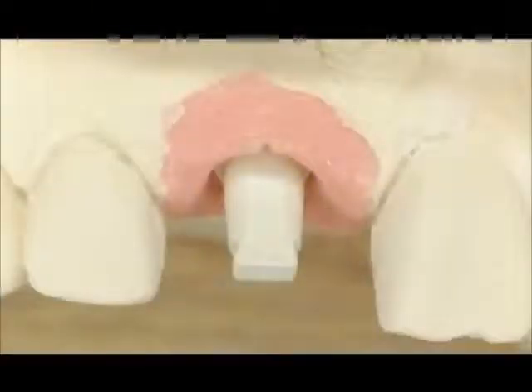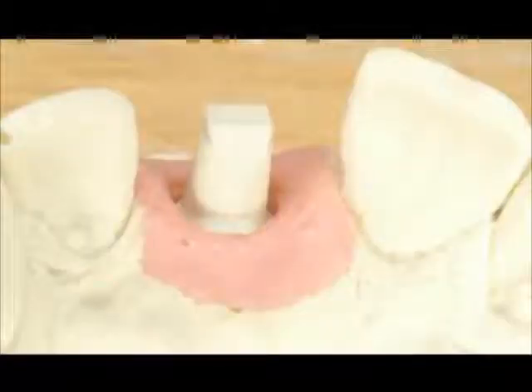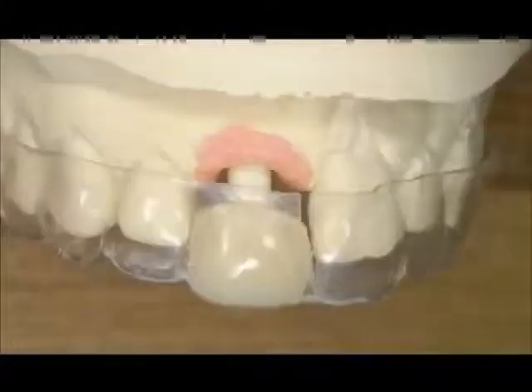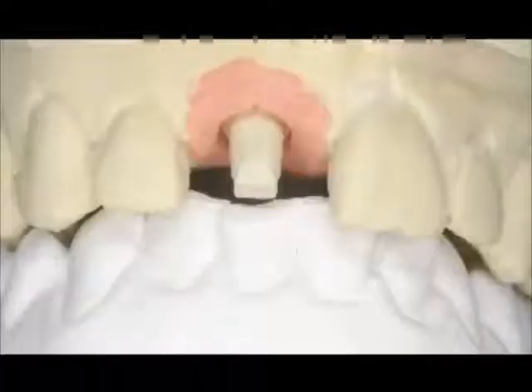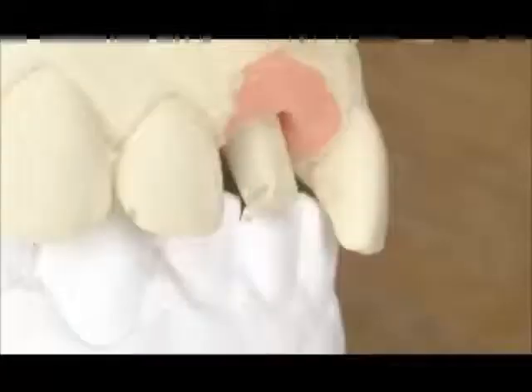This is what it would look like poured up in the laboratory model. You have a chamfered margin and you have a soft tissue rendering of what's in the mouth. And you can also use an Essex style temporary retainer if you want to, and hollow it out if you're the surgeon and don't want to reline the abutment, and that just goes over the abutment, and it's a removable appliance. Just another way to do that.